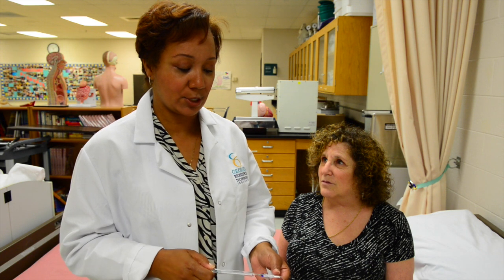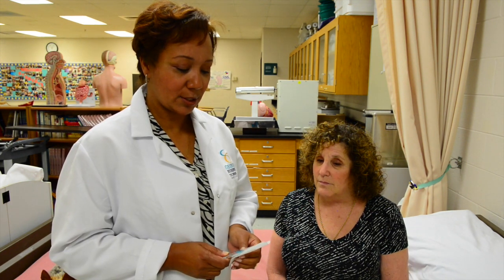You're going to shake down the thermometer and check for cracks to make sure that there is no glass that will be going into the patient's mouth. Put the sheath onto the thermometer — this protects the patient as well as the equipment.